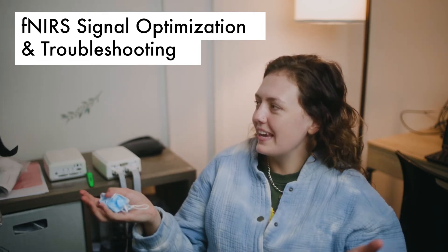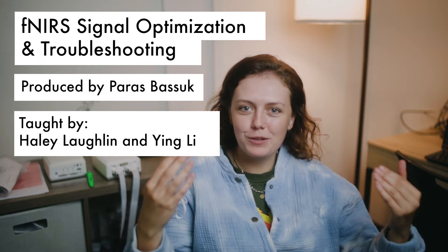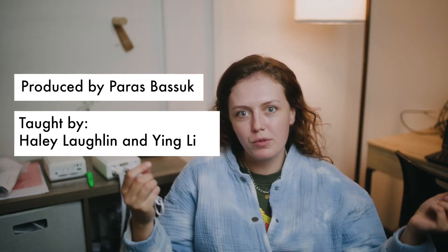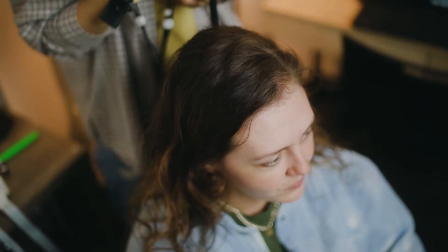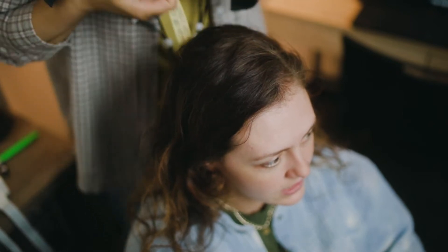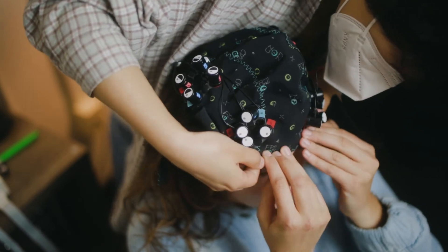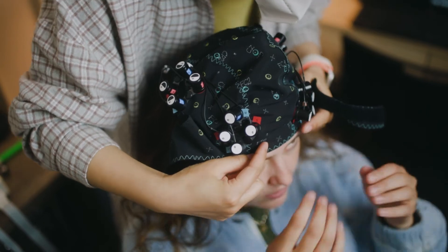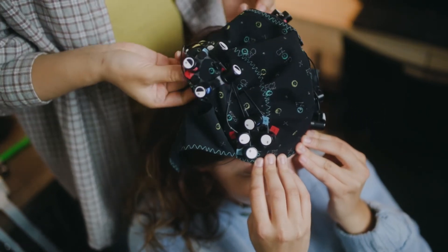We're going to be putting the cap on someone's head and then teaching people how to adjust red channels and how we move the hair out of the way to get better signal. When we put on the cap we usually have two RAs with a participant — one RA holds the front of the cap to get it centered and the other RA pulls the back of the cap, but for purposes today the participant is just going to hold it here.